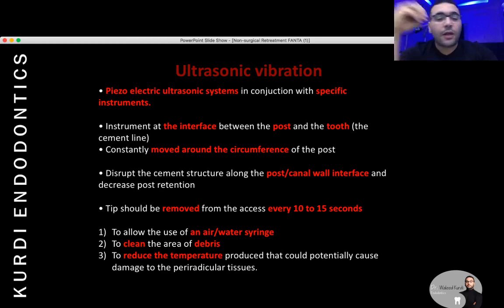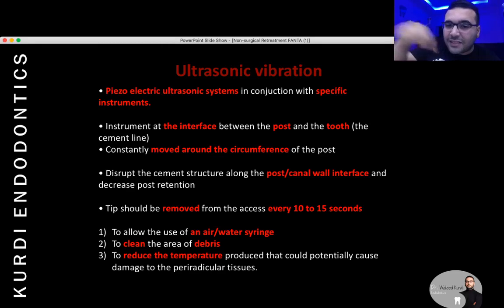Alright, so if you are going to use ultrasonic vibration, indeed we all have these piezoelectric ultrasonic systems in our clinics, in conjunction with a specific instrument or even specific ultrasonic tips. You use these tips at the interface between the post and the tooth, moving around the circumference of the post in a counterclockwise motion to disrupt the cement structure around the post a little bit.